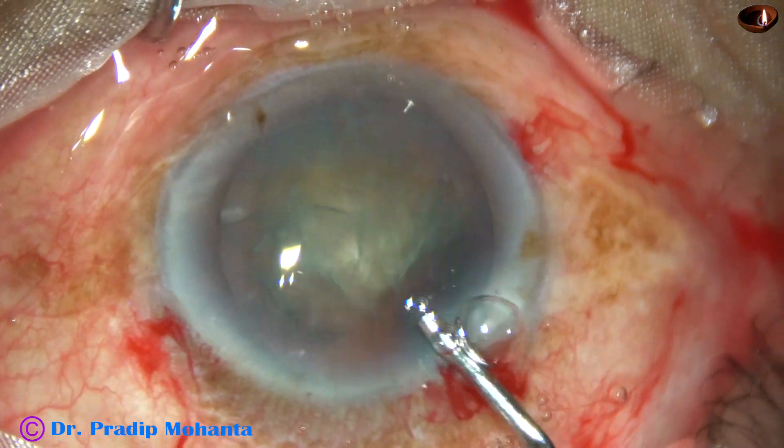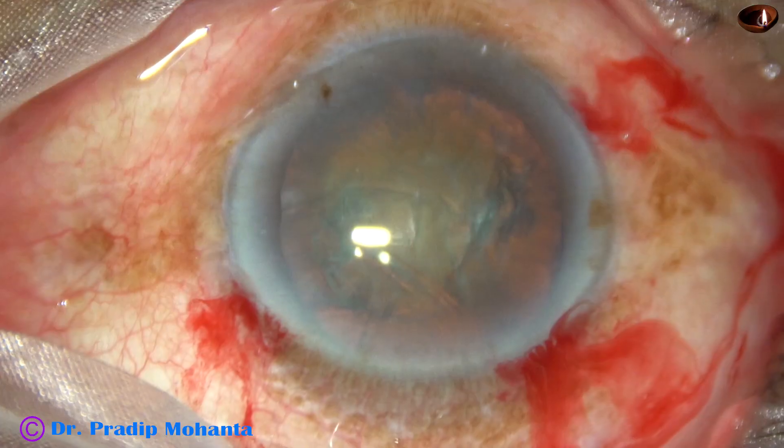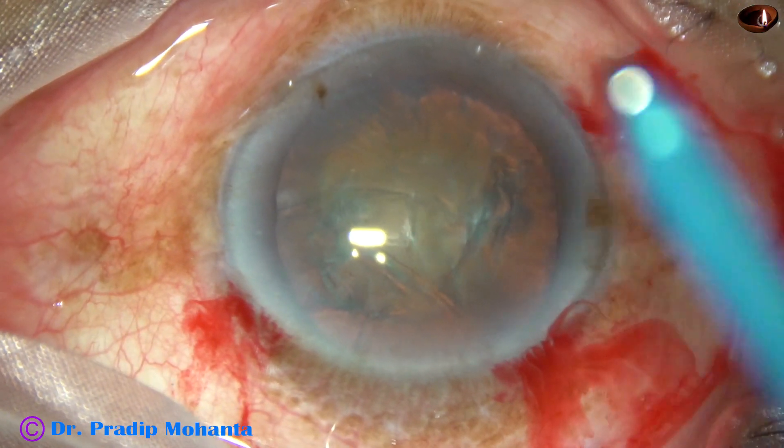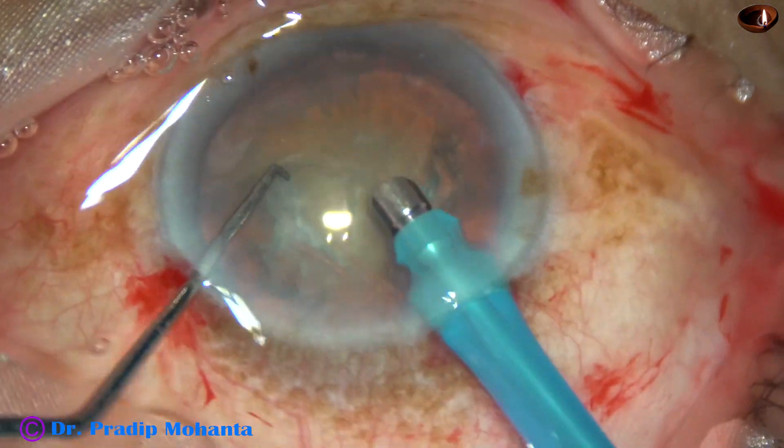And now is the time to introduce the tip of the phaco handpiece after this injection of 2% HPMC. And here goes the tip of the phaco handpiece.